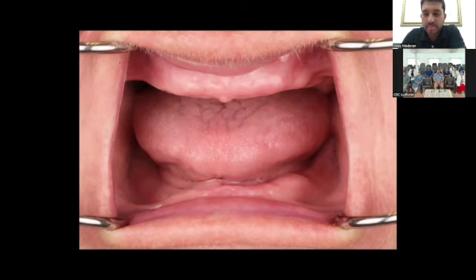But you don't have to necessarily make an interim denture. If the patient came in with an existing denture that is either broken or the teeth are not great, they're worn down, the position of the teeth is not good, you can either do a wash impression of that, scan that and then get a printed denture that has adequate lip support, good incisal ledge position. If not, you could do it the regular traditional way, where you make a wash impression, do your jaw records, and then set your teeth. So you don't have to process the denture, but at least you could do a wax setup and then evaluate your phonetics, aesthetics, occlusal plane.